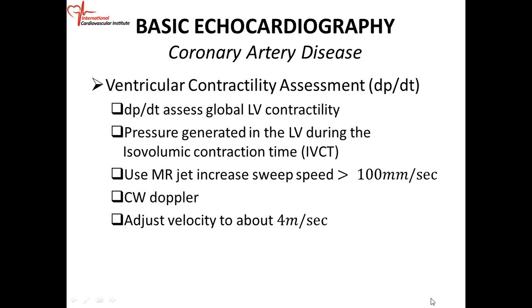The last time we did myocardial performance index, we did LIMP, which is left ventricular index of myocardial performance. The other name for that is the Tei index. It looks at the overall function of the LV. So not only systolic or diastolic, you look at both the systolic and the diastolic function. You have to know how to do that.